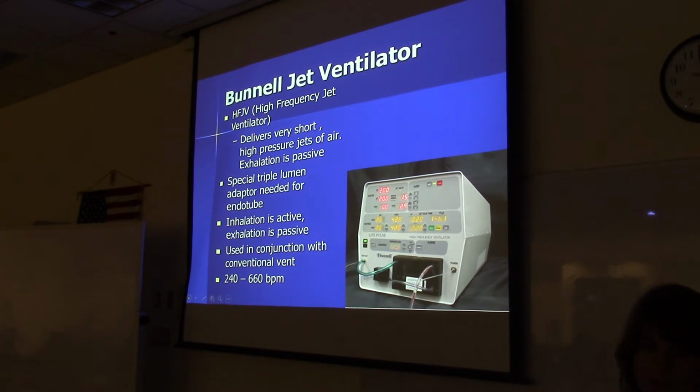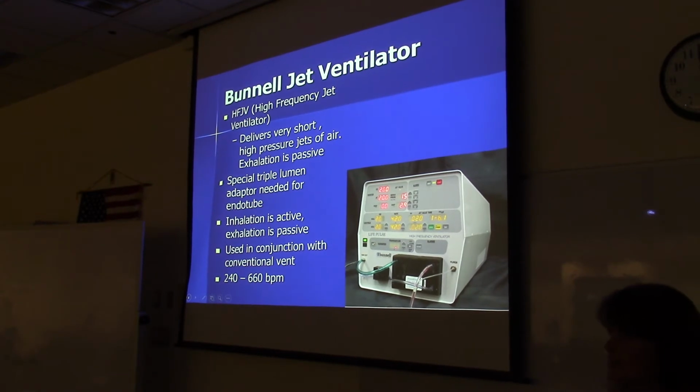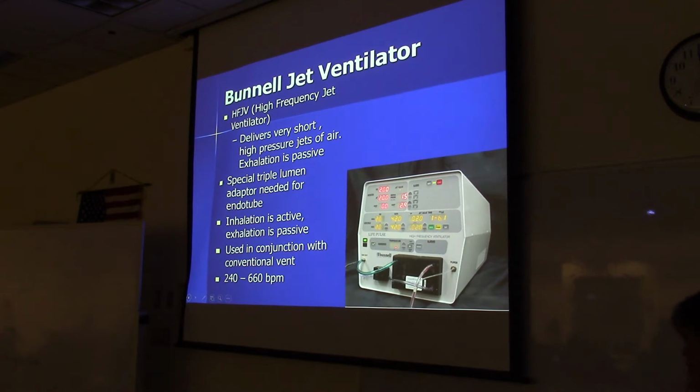All right, so HFJV stands for high frequency jet ventilation. When you're just referring to high-frequency ventilation, you could be talking about the jet or the oscillator. So high-frequency ventilation is the overall term, and to be specific, you would say jet ventilation or oscillator.